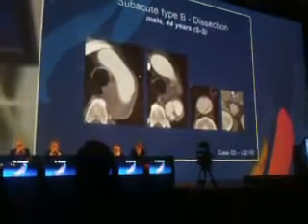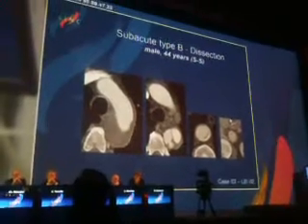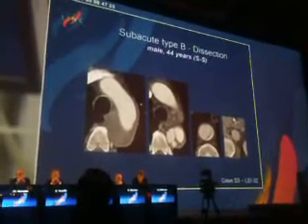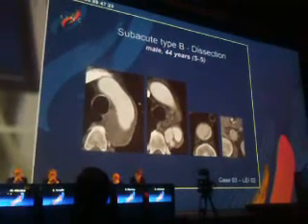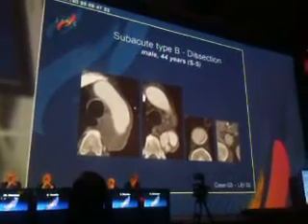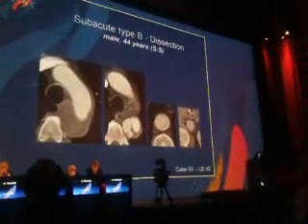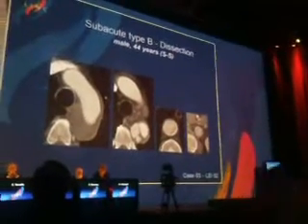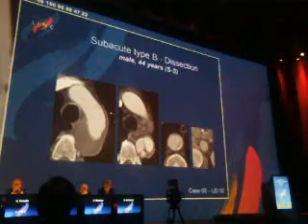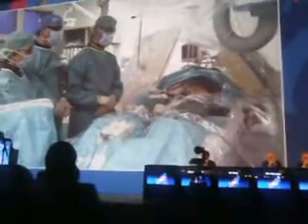He also showed up again 4 weeks after the initial CT angio. He complained about claudication, and here you can see the control CT after the first acute phase of the type B dissection with a very, very steep aortic arch. Maybe you can see in the angle later how steep the arch is, with the false lumen. And I cannot see the last picture. Yeah, the collapsing true lumen.